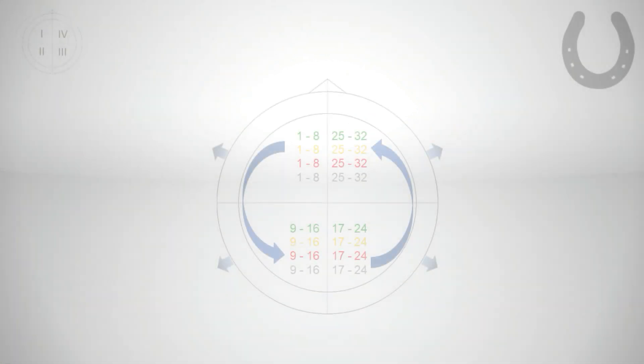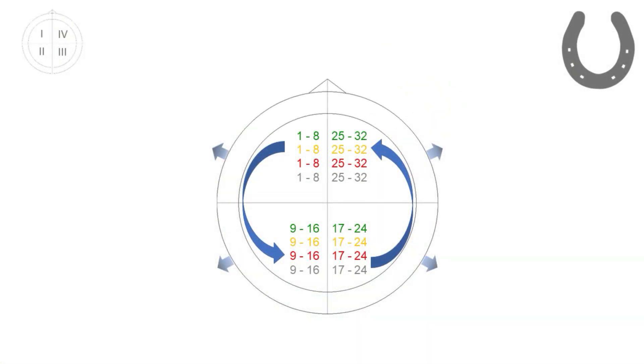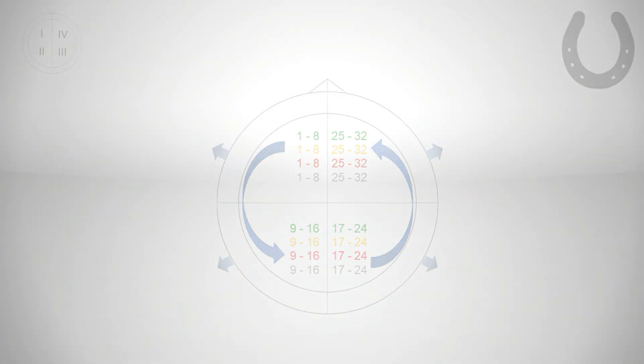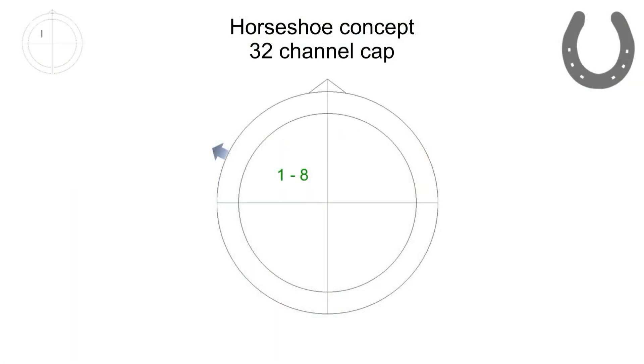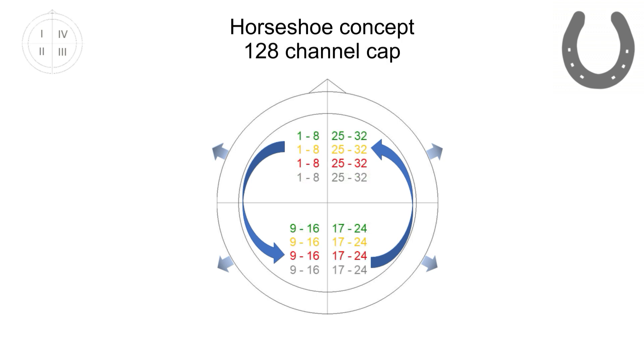Each set of 32 colored holders on a standard ActiCap snap cap is arranged in a horseshoe shape. Here, consecutive sets of 8 electrode holders are located within dedicated quadrants of the cap. This allows easy mounting of electrodes in the respective holders and prevents lead wires from coursing over hemispheres or over each other, especially with high-density caps.